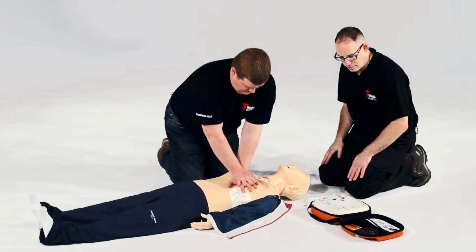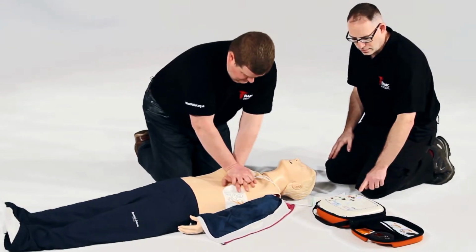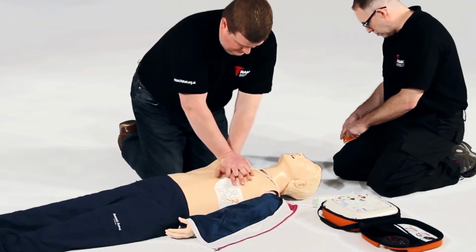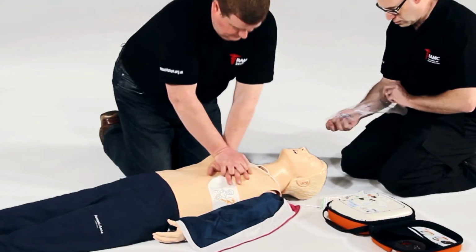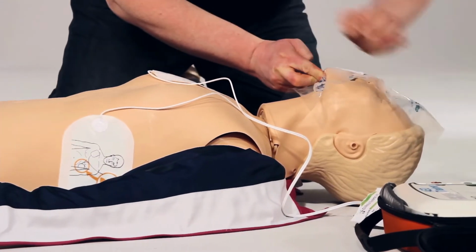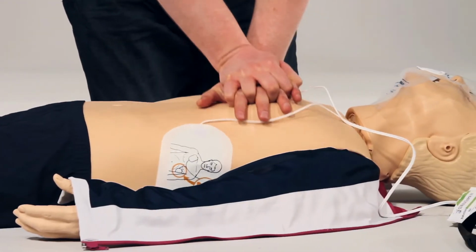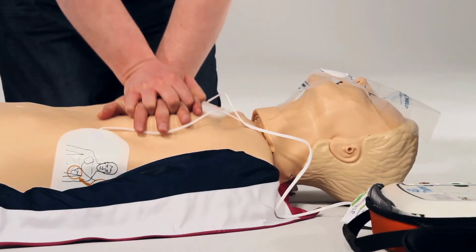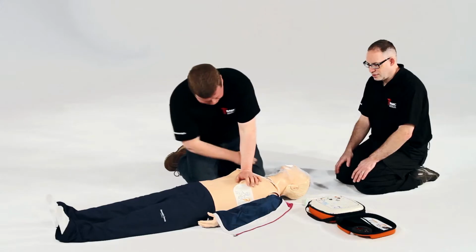Carry on. Begin CPR now. Press the flashing blue i button for CPR voice prompt. First. Second. Breathe. Breathe. Third.